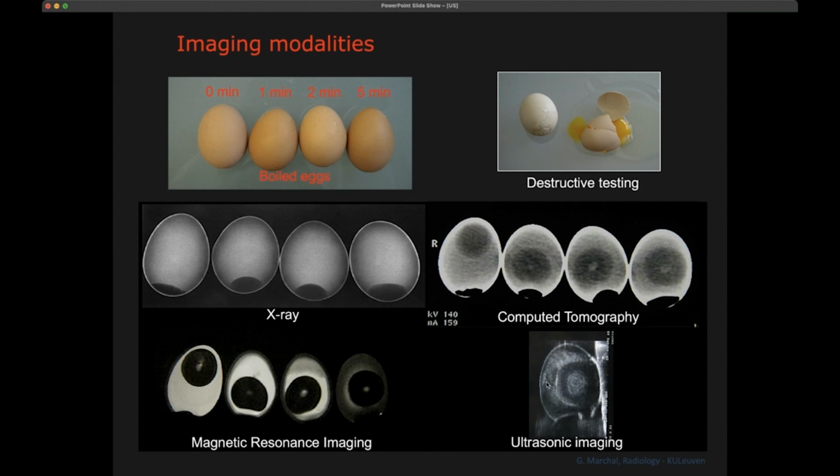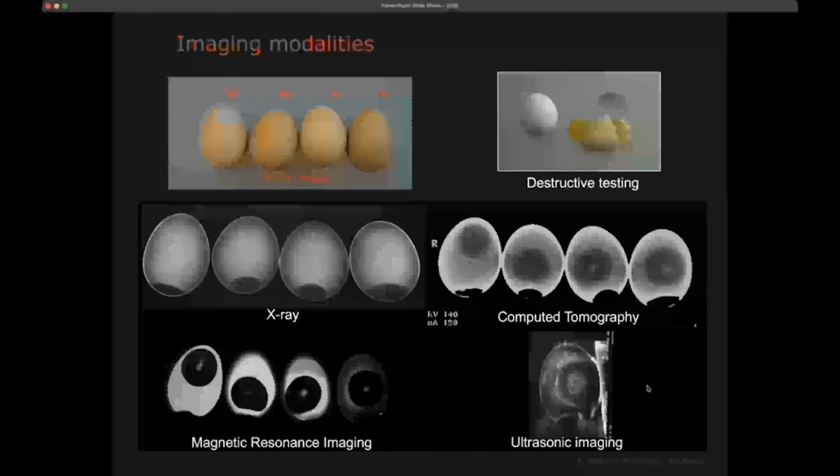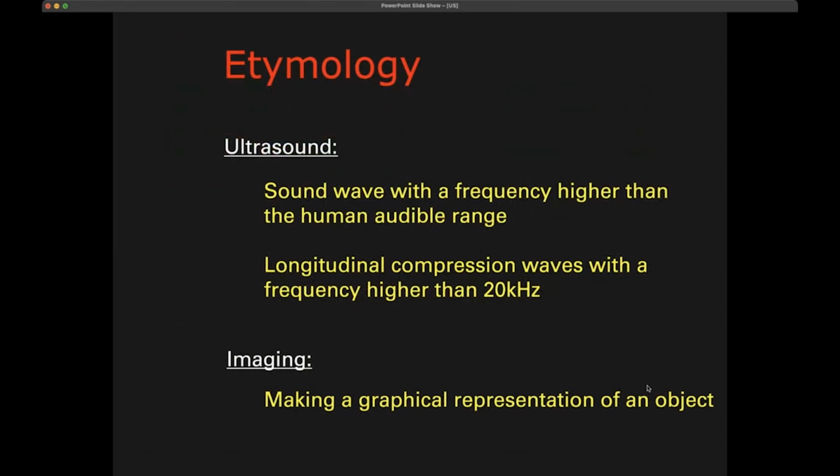One of the things you also see is that it has actually quite a good resolution. And what we will show is that actually in the direction of the scan line, ultrasound can have the highest resolution of our imaging techniques. But overall, resolution is quite difficult to determine or to define in ultrasound. So these are the things that we will cover today.